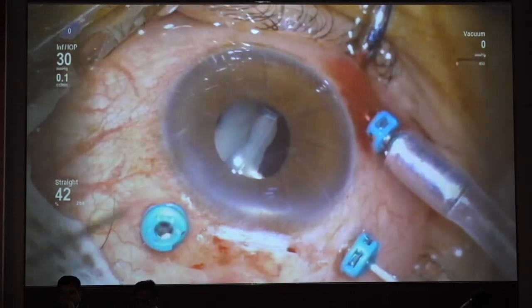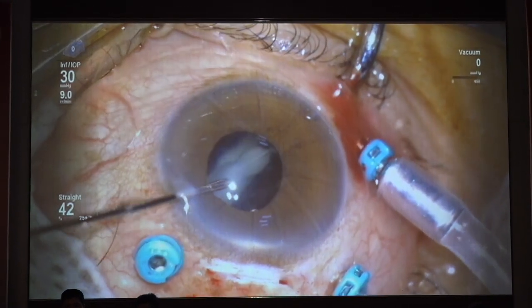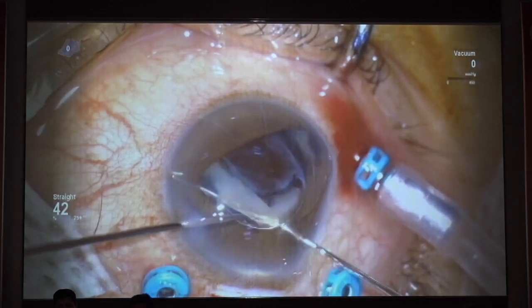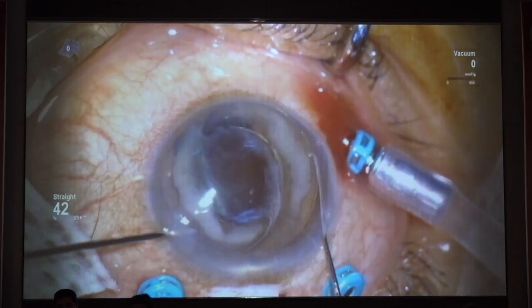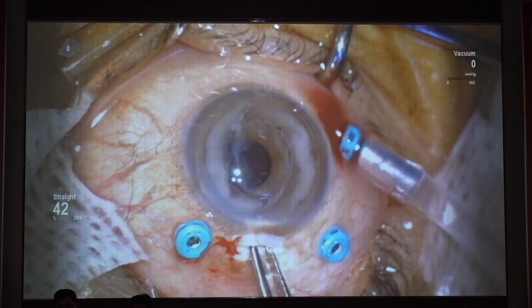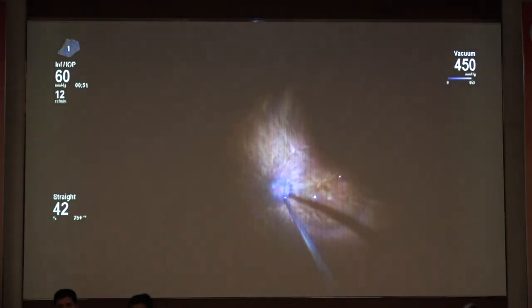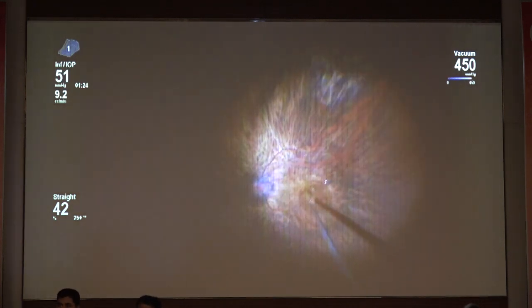Everything was falling in place. The lens was levitated up using the vacuum and then the forceps. I ensured that it doesn't slip back again. It was pulled out into the anterior chamber and it was all looking very spectacular. I was thinking I am the superstar of ophthalmology now. And then I have recently seen a few videos of Dr. Yamane doing a nice SFIOL, and I thought, yes, this is the opportunity where I can showcase my skills. Carefully removed PFCL, it was all going as per the plan.